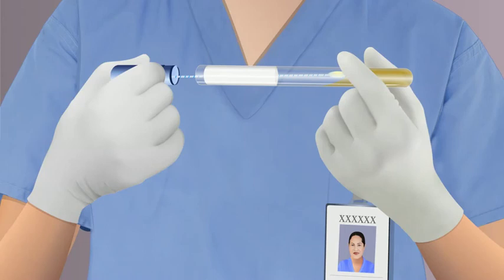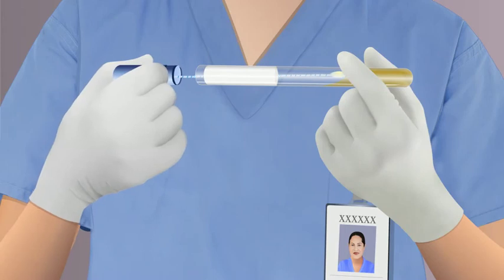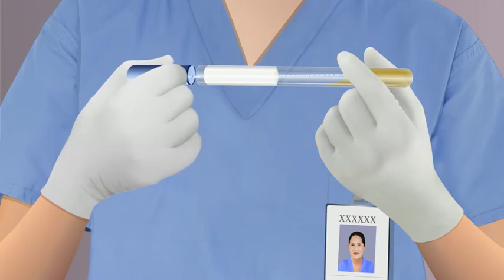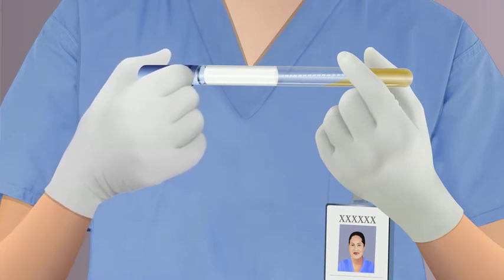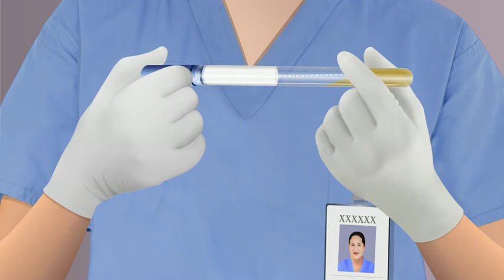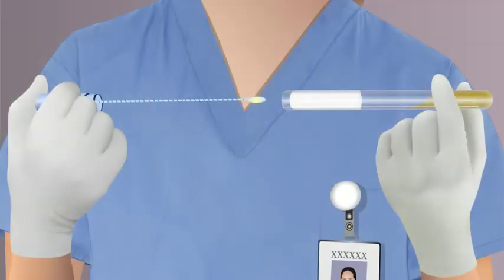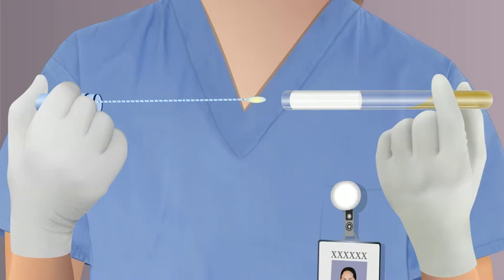Collecting a nasopharyngeal specimen for culture — swab method. Have the swab and the culture tube ready for use. If using a pre-packaged culture swab in a tube, loosen the top so the swab can be removed easily. Use a special swab on a flexible wire that can be flexed downward to reach the nasopharynx via the nose.